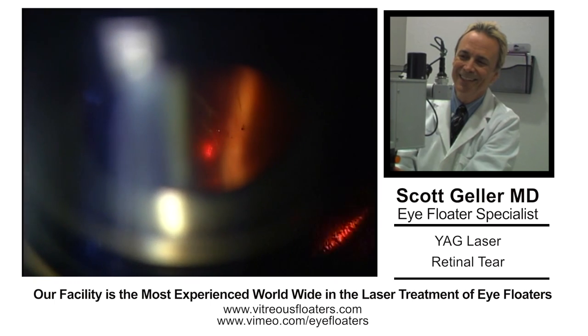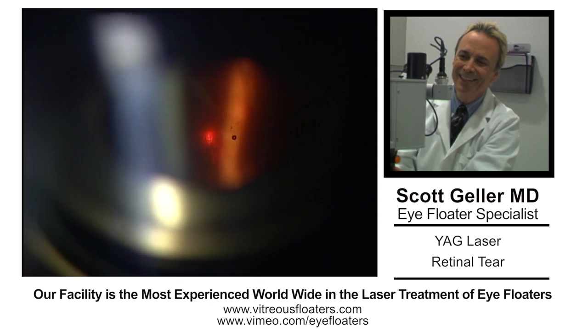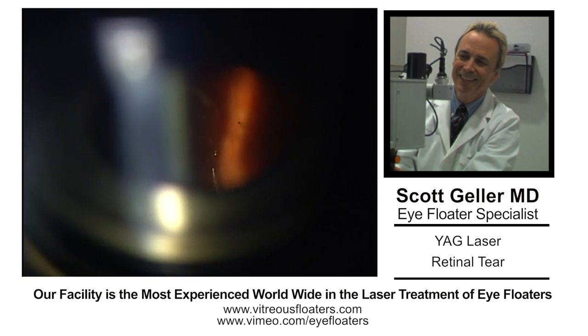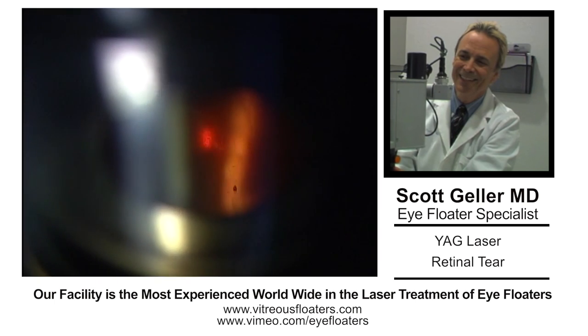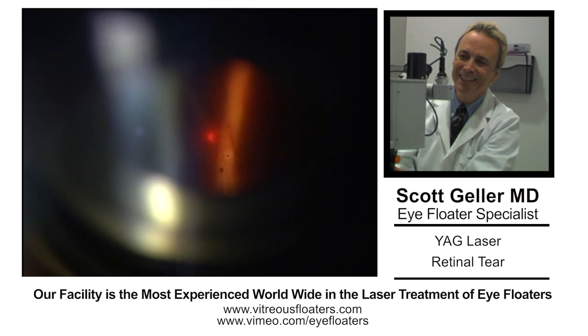So I decided to laser the traction bands and release the vitreous tag that was being pulled. I'm using a Goldman contact lens here, which is very, very tricky. If you're not experienced in vitreous laser with a mirrored Goldman lens, you need to get some preceptorship in this. I'm using a Lezog MicroRuptor 2 with a single-shot pulse. Multiple shots can cause retinal burns, especially with a Goldman mirrored lens, which is very difficult to use.